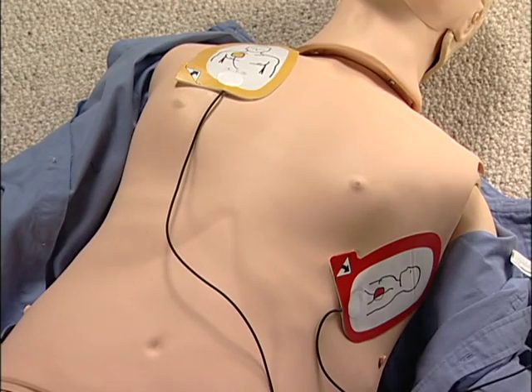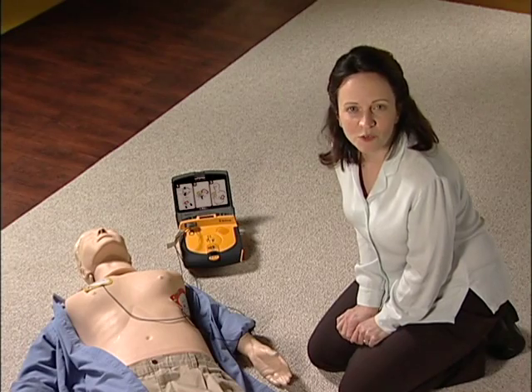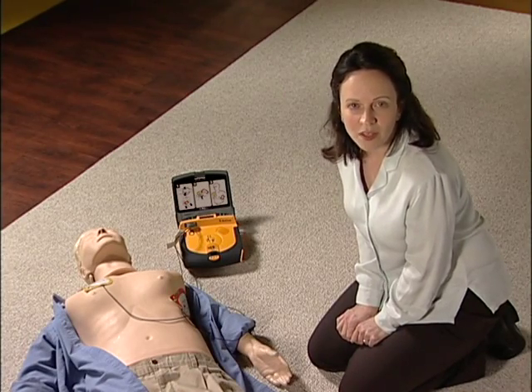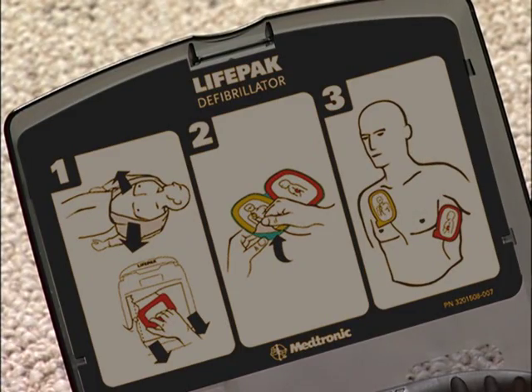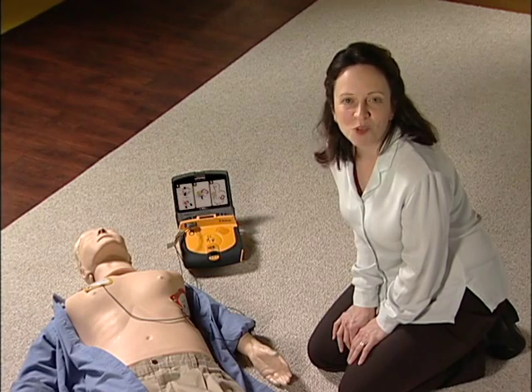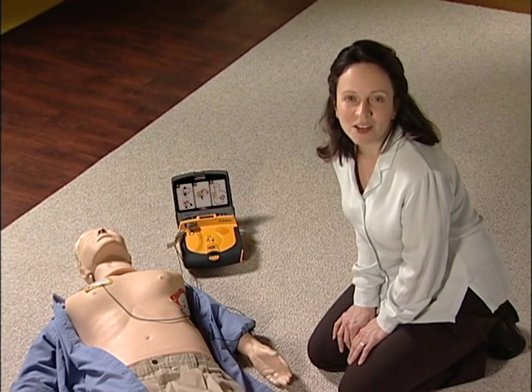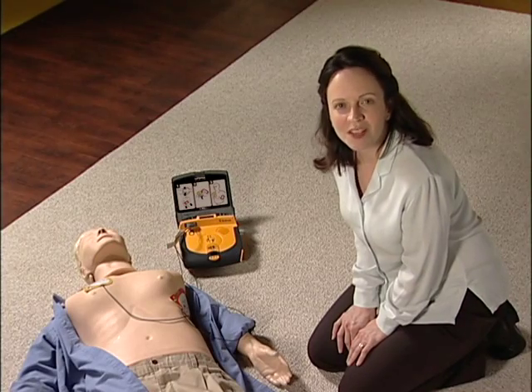The LifePAK AED will keep monitoring the patient and will tell you if another shock is needed. And that's it. Just do what the LifePAK AED tells you from the moment you turn it on. You can also refer to the quick reference guide inside the lid if needed during an emergency. When the emergency medical team arrives, you may have saved critical time by starting treatment before they get there. Even better, you might have just saved a life.